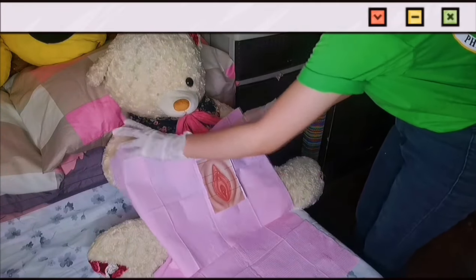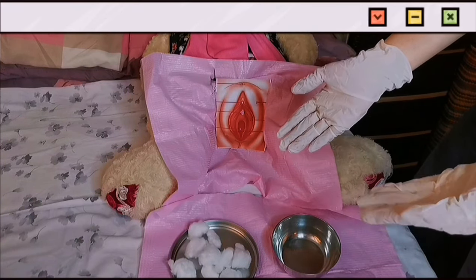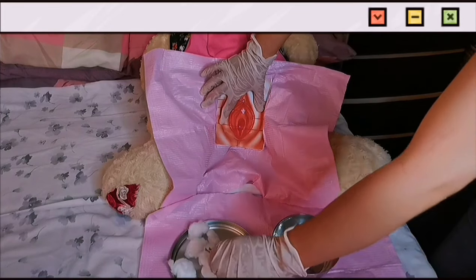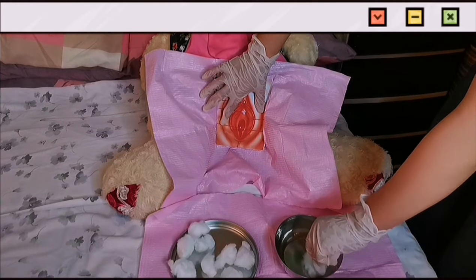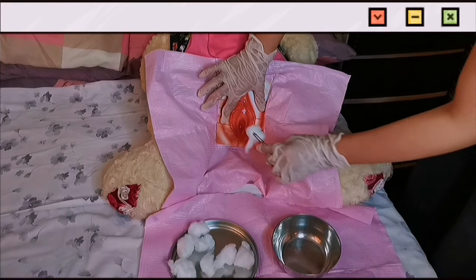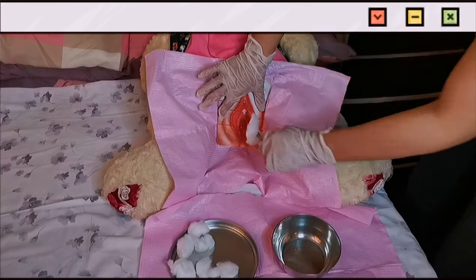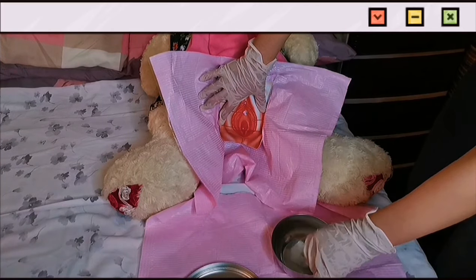Next, we will be wiping the vagina using cotton balls and warm water — assuming that we have warm water. You can also use washcloths if available. First, spread the labia. Then, from each corner, use one cotton ball each and discard it. From upper to lower. The last cotton ball will be at the middle.